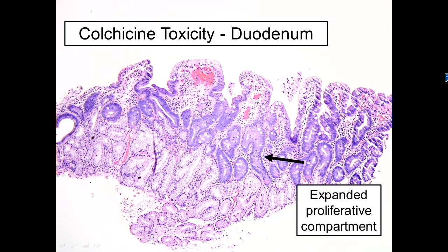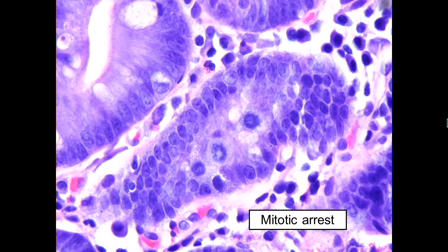This is a beautiful duodenal biopsy from a patient with horrendous diarrhea who was taking colchicine. You'll notice that the crypts are expanded — here are the Brunner glands — so the villi are a little on the short side by default, but it's not very inflamed. At high magnification, we can see the telltale sign: we're in the proliferative compartment and we have mitotic arrest.